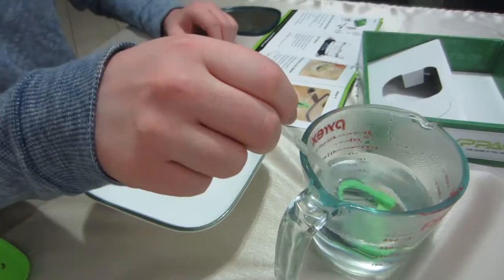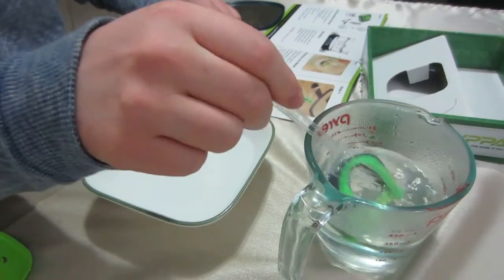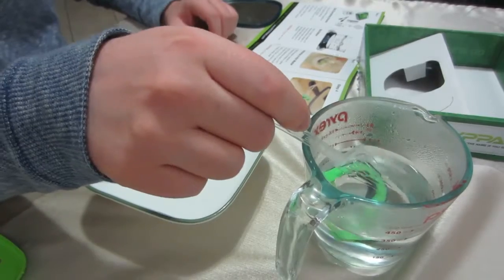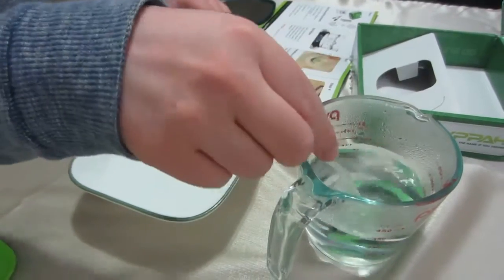A couple more seconds and it should be ready. I did read that it gets a little sticky, so you've got to hold it on the part of the dark plastic. Okay, looks good now — let's scoop it out.